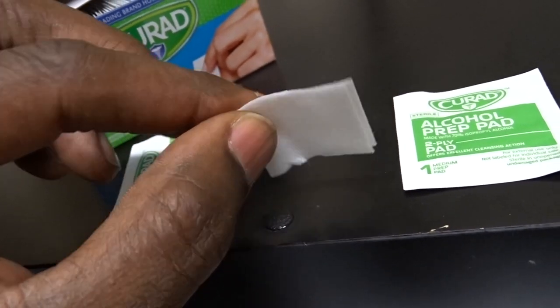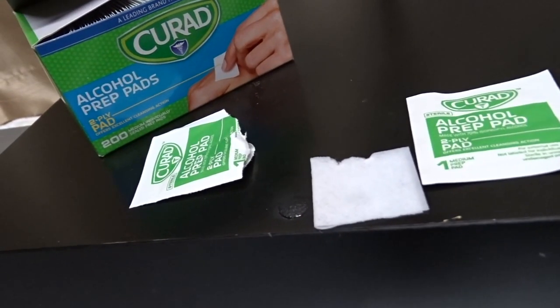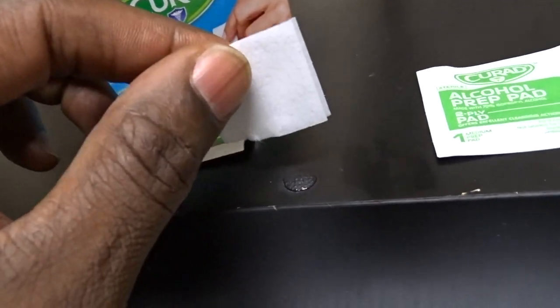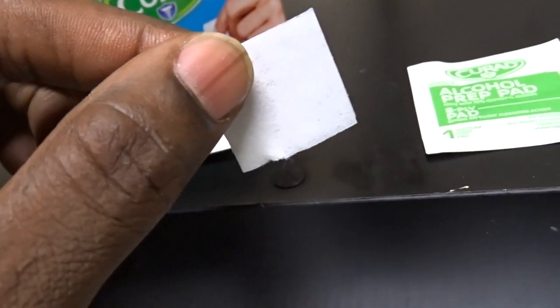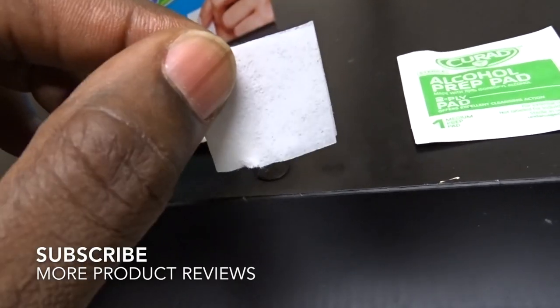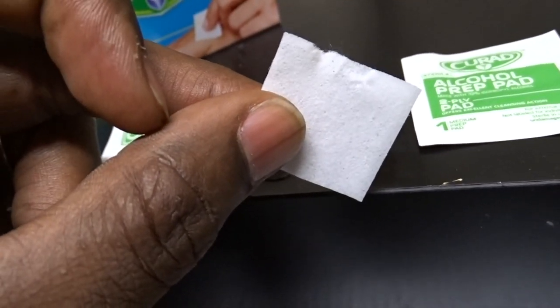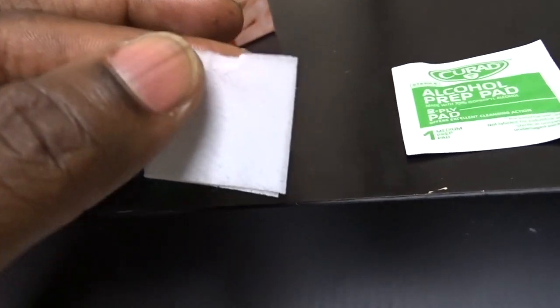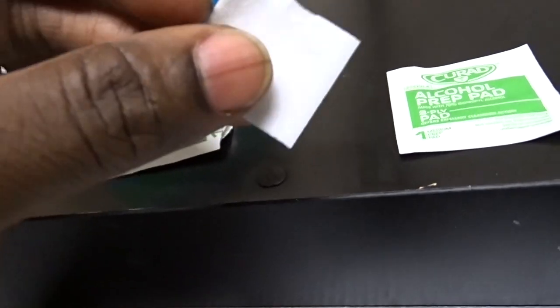These work really well — they're saturated just enough. I've tried certain brands that tend to be a little dry and not saturated enough with alcohol to get a really good clean done. Curad pads work really well; they clean the area properly and I usually use two of them before sticking a person with a needle.